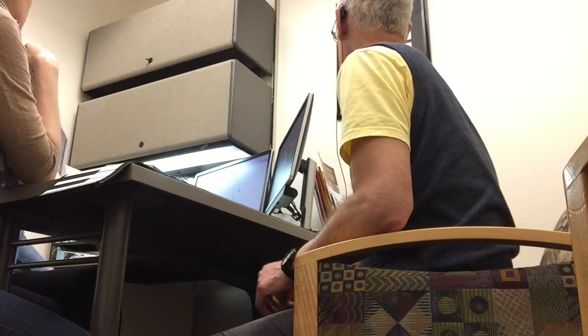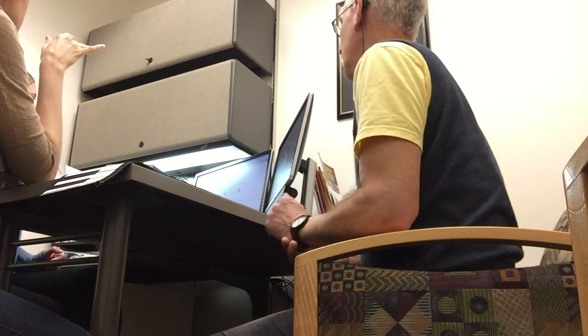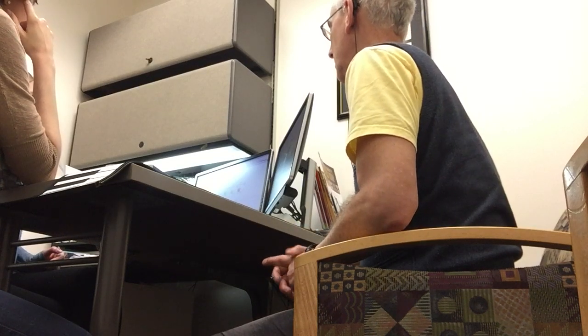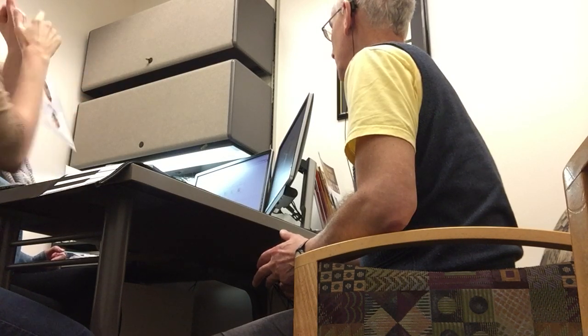Cancel all that. And then go ahead and write to the processor. And assume it's 1, 2, 3, 4, and that's for yes. You write to the processor. Yep. So it's 1, 2, 3, 4. Yeah, okay.